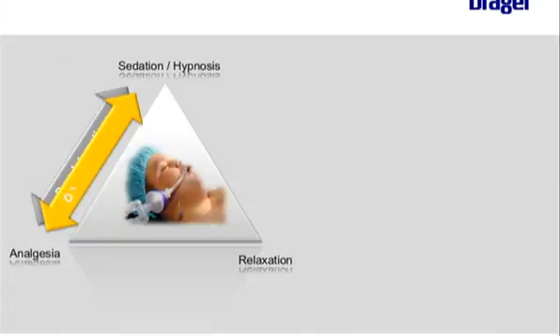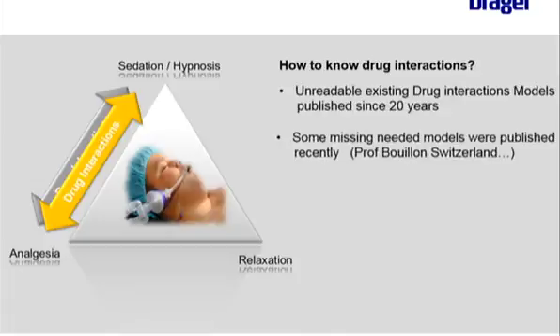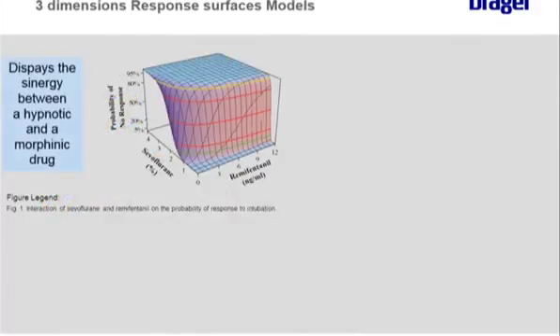As I told you, the most important thing is the drug interaction when you are pushing the drugs inside the body of the patient. How to know this? There have been plenty of studies for 20 years in the field, though they are difficult to read, from Minto, from Schneider, and all these models exist today. There is also a more recent one developed by Professor Bouillon and others from Switzerland. This is how it looks, very difficult to interpret.